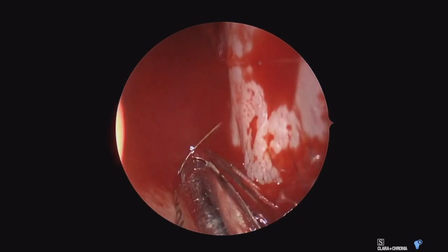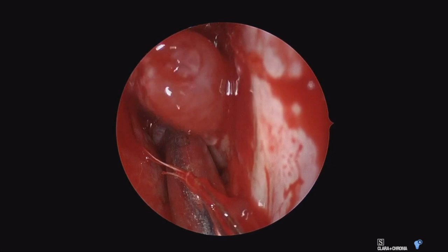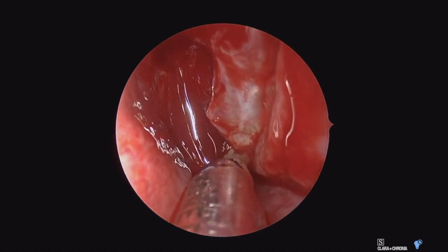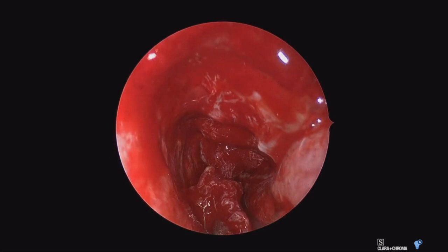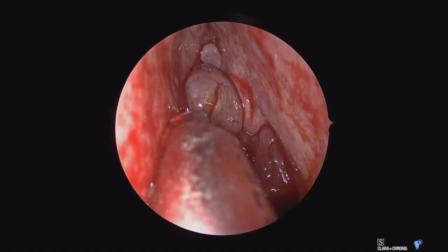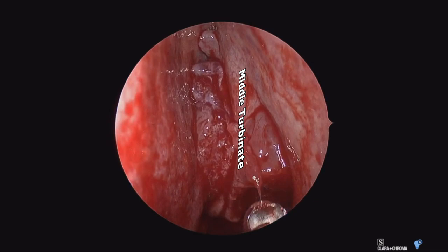A large portion of the tumor has been taken for permanent section pathology. We'll debulk this lower portion of the tumor with a microdebrider — the portion that is simply free-flowing in the nasal cavity without any mucosal attachments. Here's that last bit of tumor in the nasopharynx being removed to allow more ready egress of blood flow throughout this case with this vascular tumor.